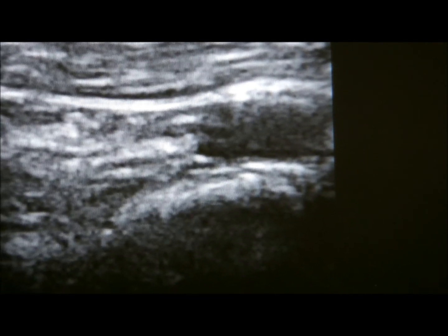So in a gist, we went through the aorta, the pancreas, the kidney, the liver, the gallbladder, the small bowel, the large bowel, the stomach a little bit with the signs of perforated gastric ulcer, and the appendix. So this is in a nutshell acute abdomen ultrasound.